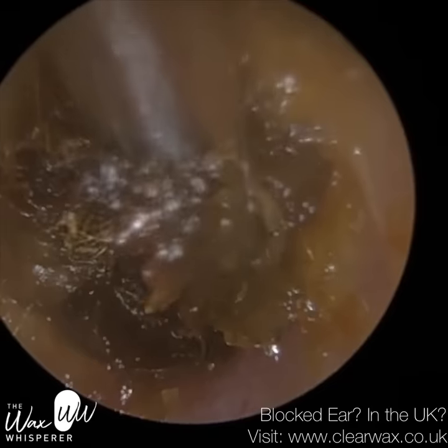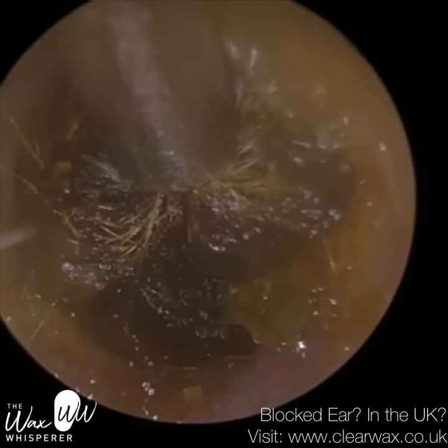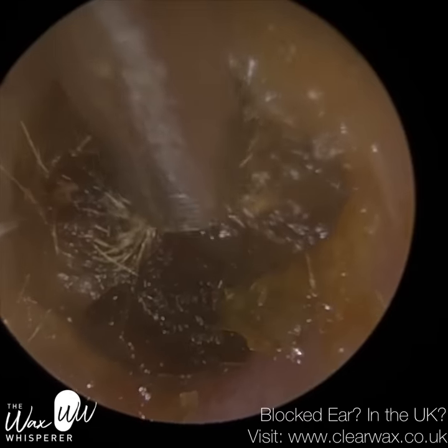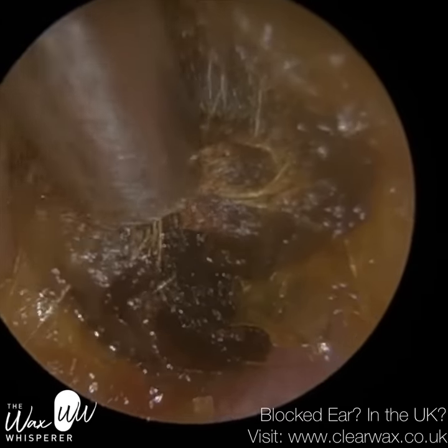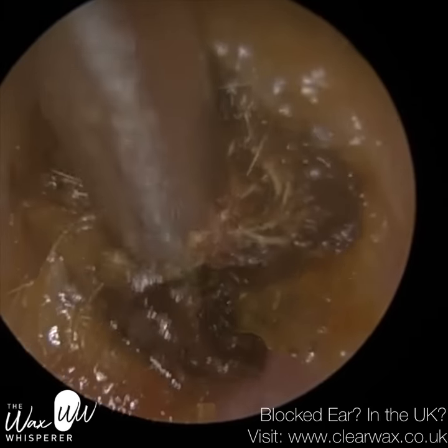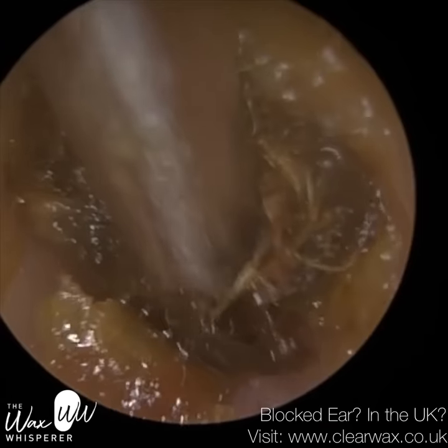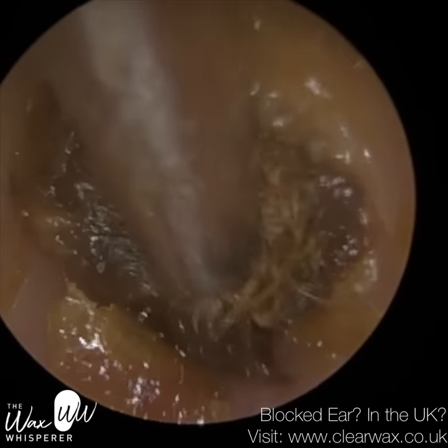And I've used head magnifying loops, which I feel are quite limited in terms of magnification and depth of view. With an ENT microscope, yes, the magnification is great, but one of the things that people often say is that it gives you binocular vision, and binocular vision is seeing an object with both eyes independently, and your brain can then merge the two images and it gives you depth perception.